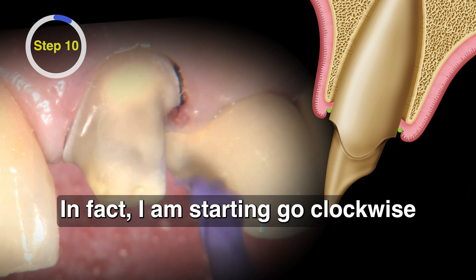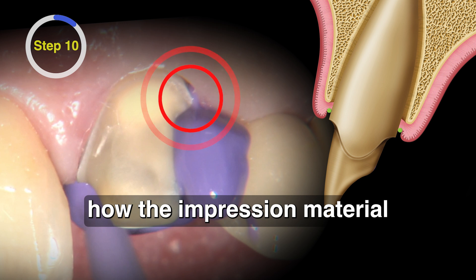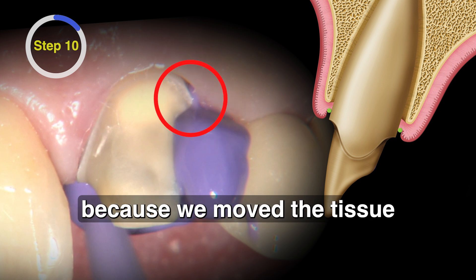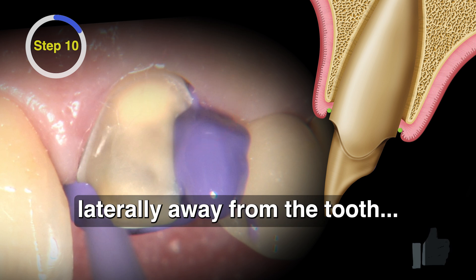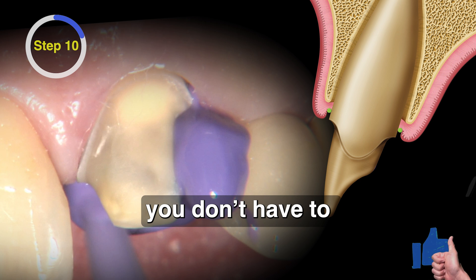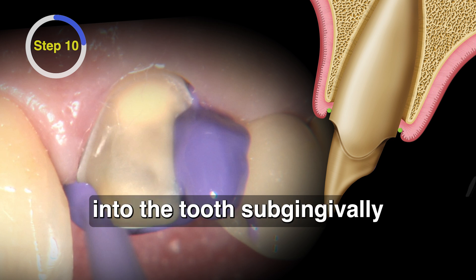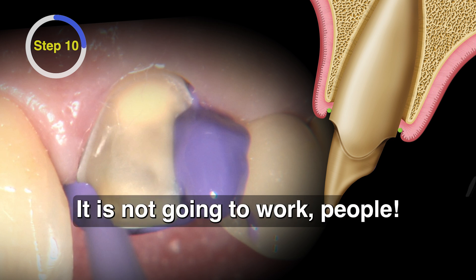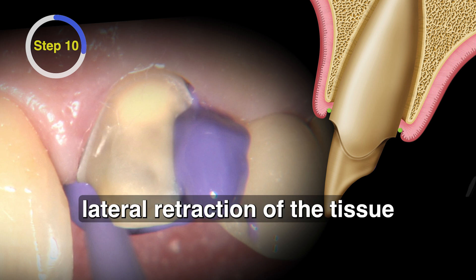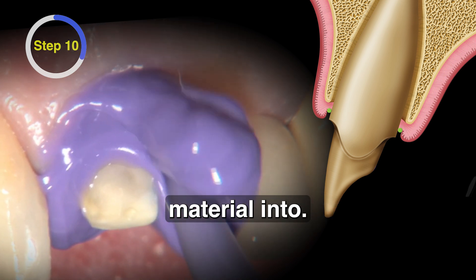I'm starting to go clockwise around this preparation with the impression material and you can already see how the material started to go counterclockwise, because we moved the tissue laterally away from the tooth. Dentists seem to persist in this vision that you don't have to move the tissue away — like finding a super thin impression material or jamming the tooth subgingivally. It's not going to work. You have to create lateral retraction of the tissue away from the tooth to get a wide open sulcus to put your impression material into.